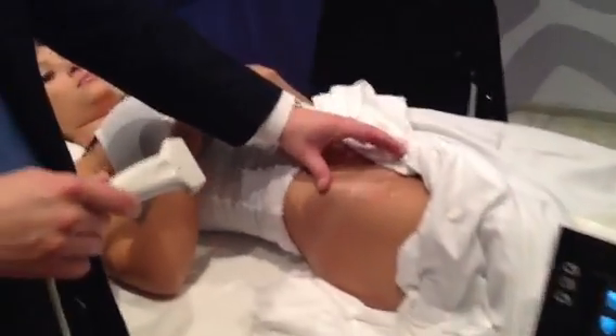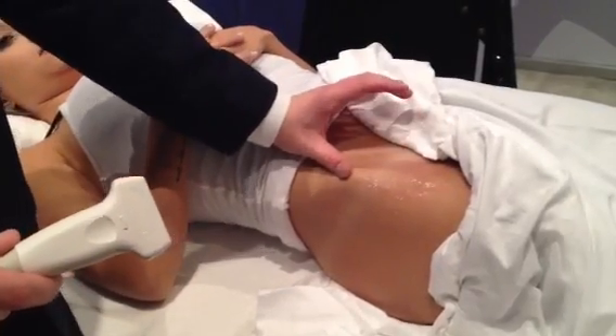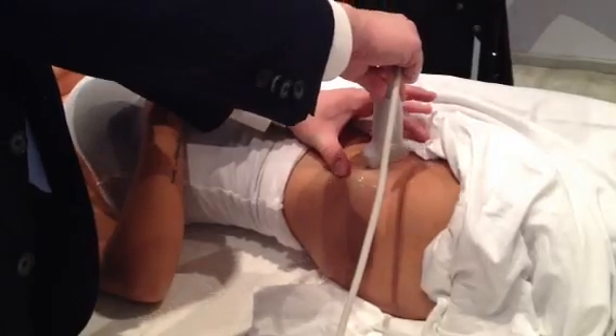The first thing we want to do is identify the starting point. The starting point for this injection is to go between the ASIS and the pubic bone and drop your probe right on that line.